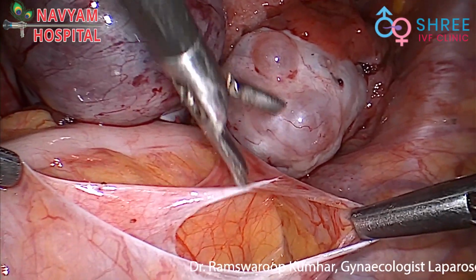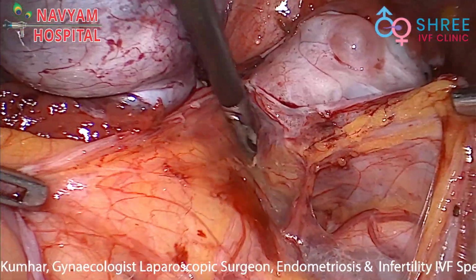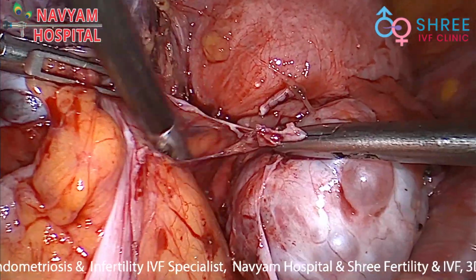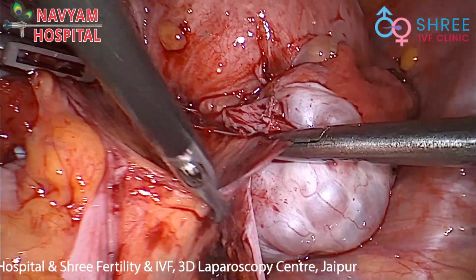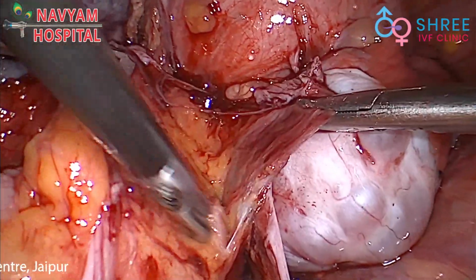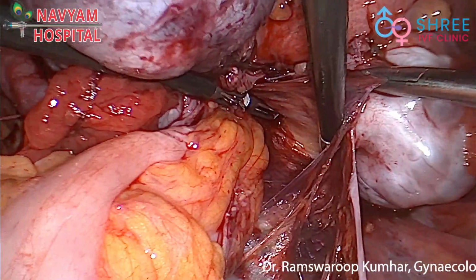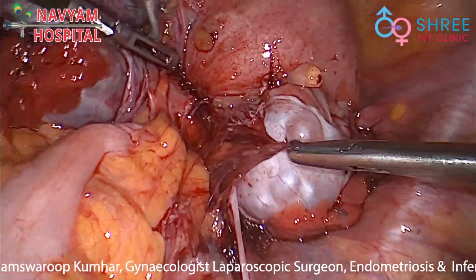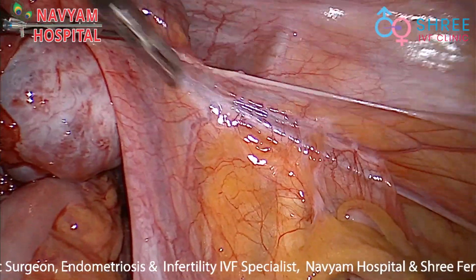First, we dissected the ureter very deep. Then the bowel was dissected away from the right tubo-ovarian mass. A proper plane was achieved by blunt as well as sharp dissection. And the rectum was released away from these adhesions, and we reached the lateral pararectal space deep down. But before that, we have to secure the vascularity.